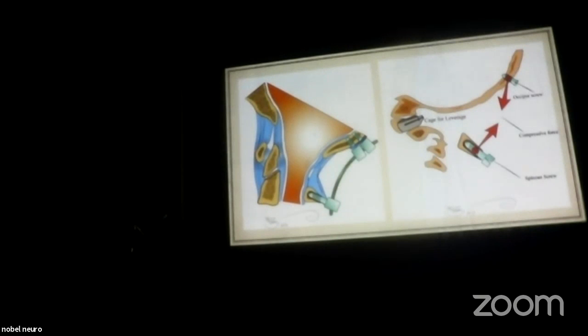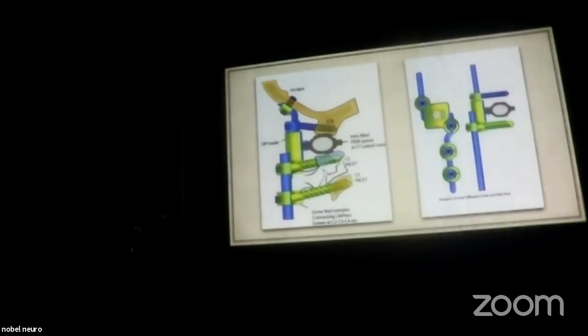This is the DCER technique, if you know, odontoid fracture, and there is a gradual flexion at the CVJ, and there is a cord compression. So I have made an entire series of what is the mechanism of the instability and how do we do that. So this is Dr. Sarath Chandra's personal technique. It is published. These are some instruments that he wanted for himself. So he just described with me, and I have created this set of instruments for him. So this is in the process of patenting.